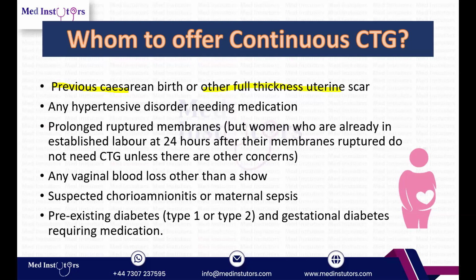So now guys, tell me, why would you offer someone who has been given a trial for VBAC continuous CTG? What do you want to try to determine or pick up that would be helpful? You can all type it in the chat box, guys, so that I know if you're thinking on the right path.